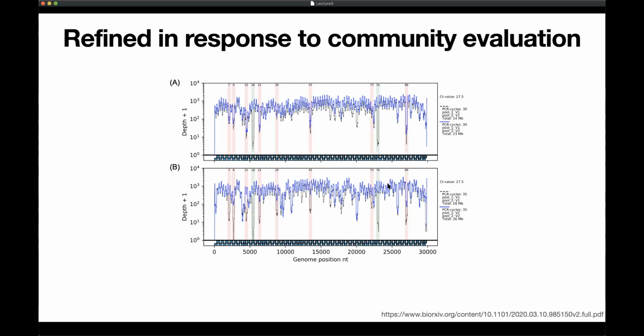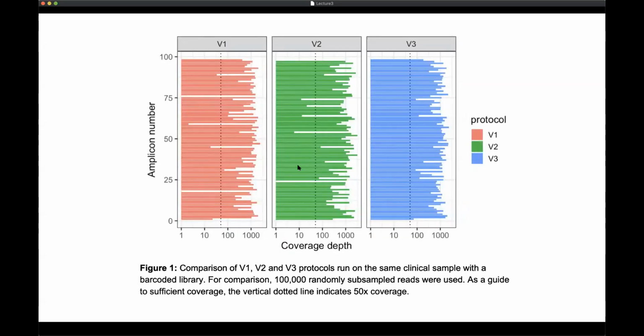And then following additional analysis, they identified some of the issues. For example, some of the primers are self-hybridizing, which is something you should be avoiding. So the primer set was revised and improved.